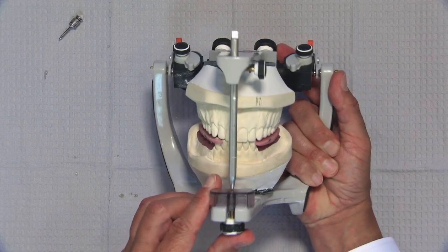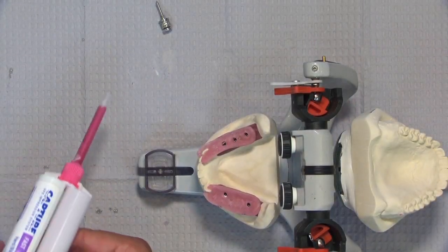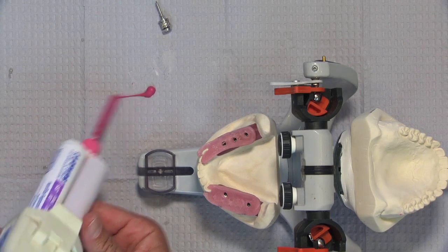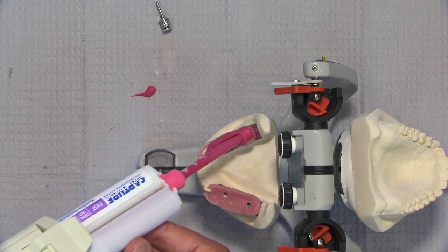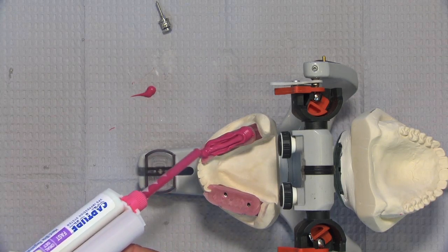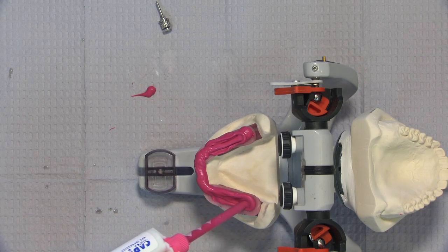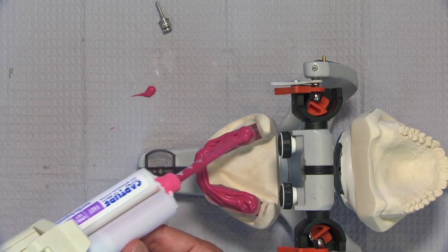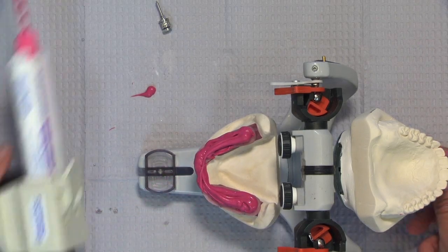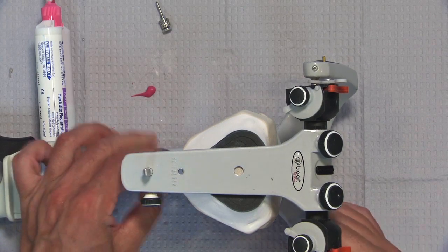Let's go ahead and do our bite registration. Any polyvinyl siloxane bite registration material happens to stick very well to the light cured guide itself. So there's no reason to put any kind of bonding agent here. This is going to stick to it. In fact, it's very difficult to get it off if you ever wanted to. If you wanted to take it off in your office and do the bite for a second time, you'll see you need to get a scalpel out and really go through a little bit of work to do this.